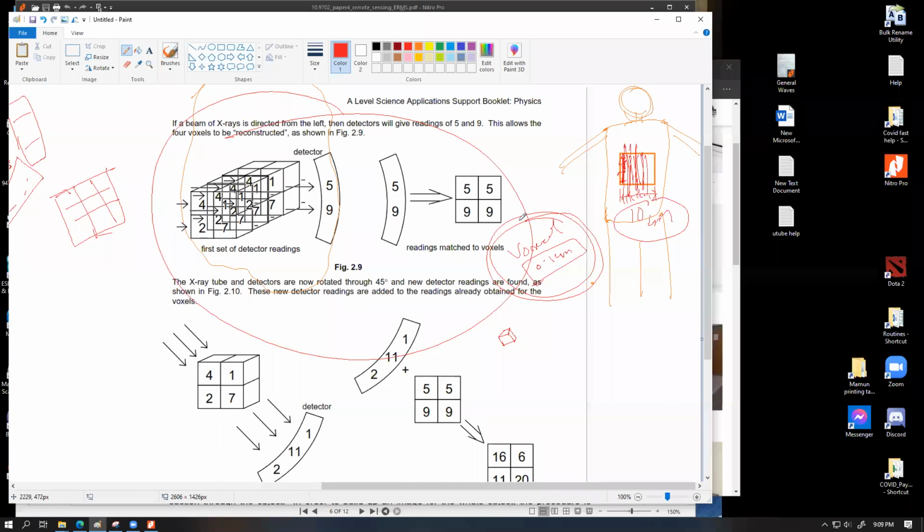For example, let's say you're trying to find stage 1 cancer cells with a CT scan. I'm not sure if they are achievable by CT scan, but stage 1 means that it's not very spread out. It's in a single location, and the tumor is currently benign, not malignant. So for those cases, it's not very large. You might require a very small voxel size, because you want to properly scan all the itsy-bitsy parts to find very small indications of anomaly.